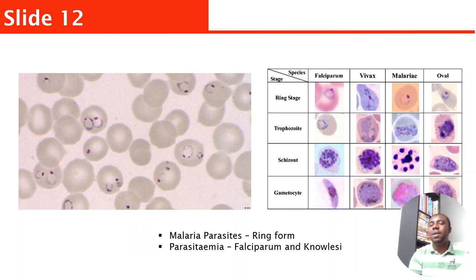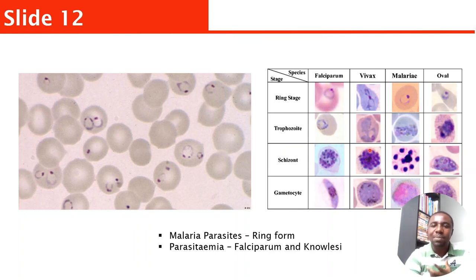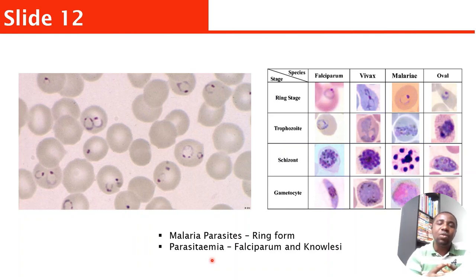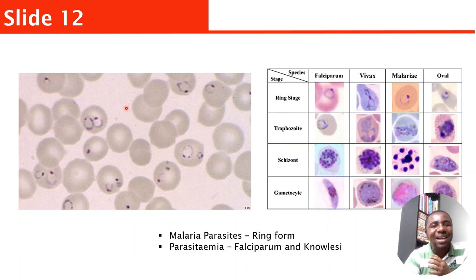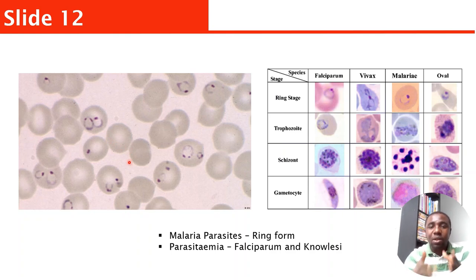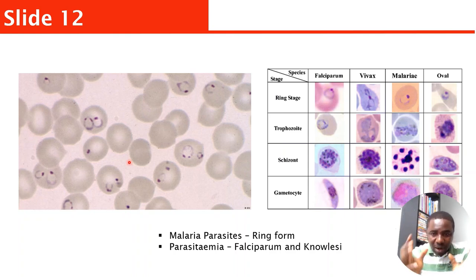This is malaria. You can see a lot of malaria parasites here, and they are all ring-form. You might need to look at different species and different stages of malaria parasite. Most likely they may give you ring-form malaria — tell them it is ring-form. If it is falciparum or knowlesi, you will need to do parasitaemia — meaning you quantify the amount of parasites in the red blood cells. Remember, you see the parasites inside the red cells, not outside them.